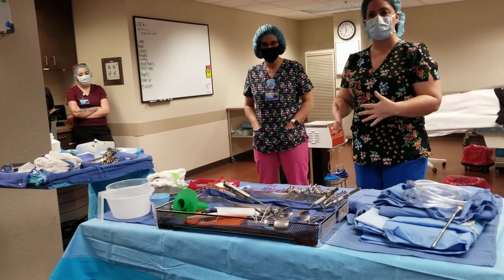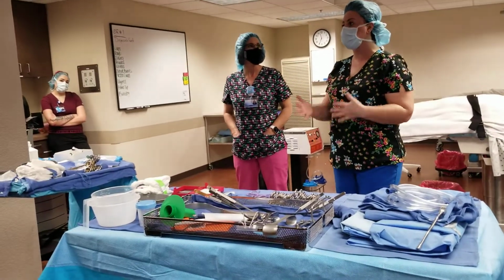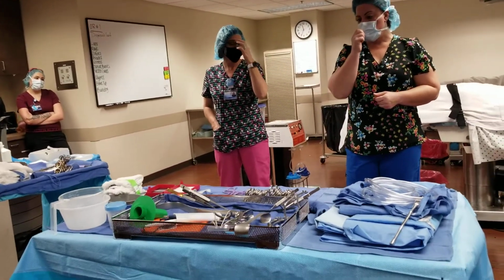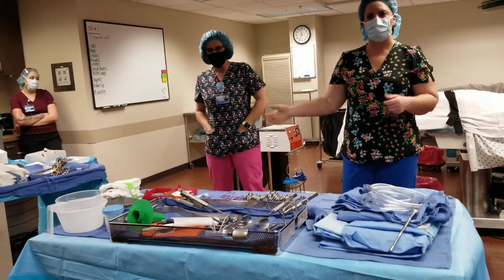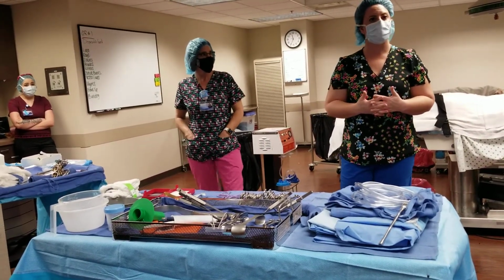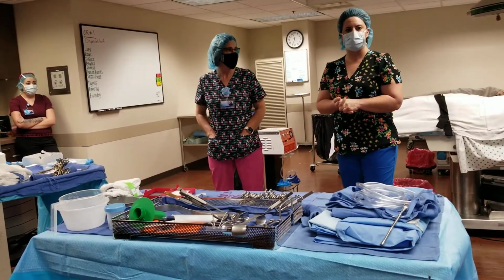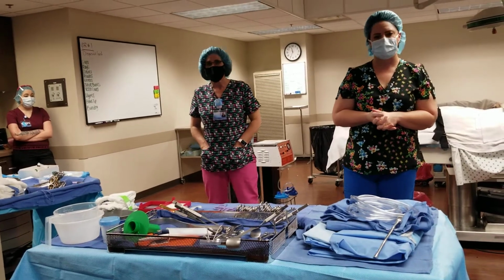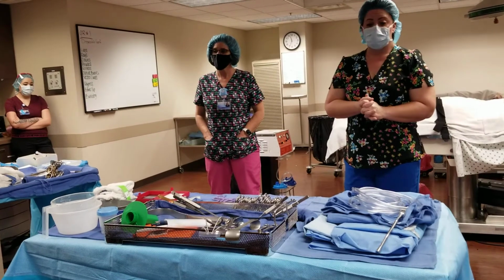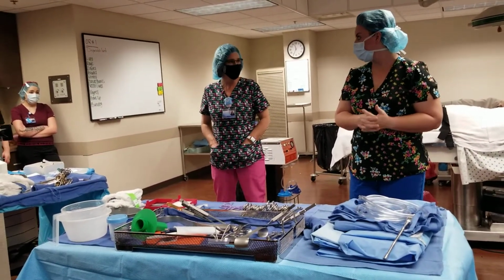Probably when they're closing adipose or getting close to being done closing adipose, go ahead and initiate your final disposable count then, because by the time you are ready for the staples, it's like boom, boom, boom, they're done, and you really don't have time to count. So maybe as instructors we can just say, okay, we're closing adipose, and that can be your trigger. And then just wash up and dress it, and we just had a birthday party.